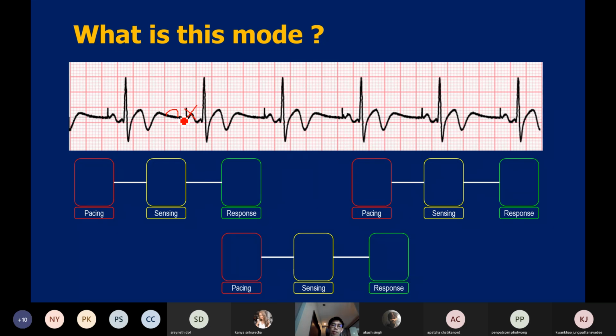อันนี้เข้าใจไหม เข้าใจครับอาจารย์ If I have one another question. If the pacemaker sees the intrinsic rhythm of the myocardium of the patient, right? So it will not deliver the new signal, right? It will not pace the new signal. Yes, if the response is inhibit, it will not deliver or generate the rhythm.